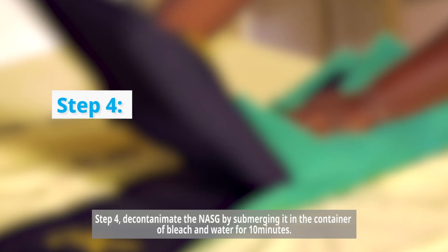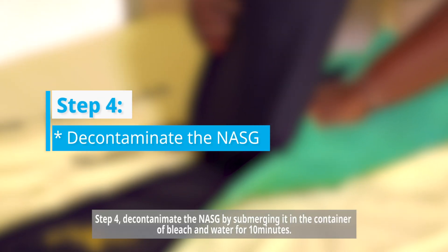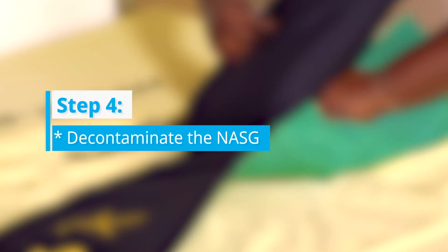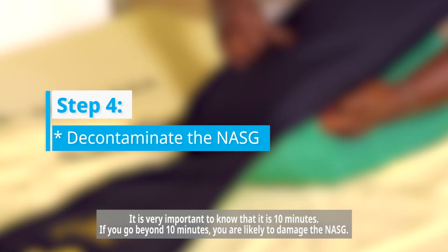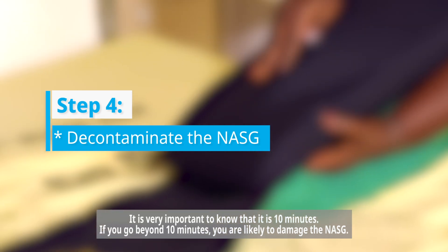Step number four: decontaminate the nasig by submerging it in the container of bleach and water for 10 minutes. It's very important to know that it is 10 minutes. If you go beyond 10 minutes, you are likely to damage the nasig.